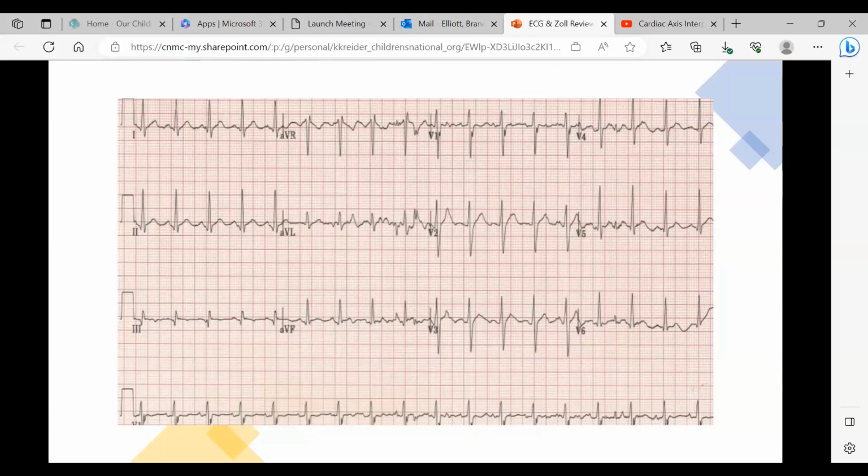You have to prompt it because it's not going to tell you the changes. Some machines can say there's absolutely something going on. Right, I know Physio products will, if it senses the changes, constantly passively monitoring. And if it senses the change, it will print. Ours does not do that. Okay. All right, so now I think Danny's on the hook for the next one.